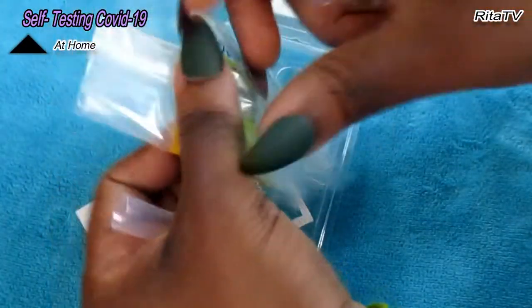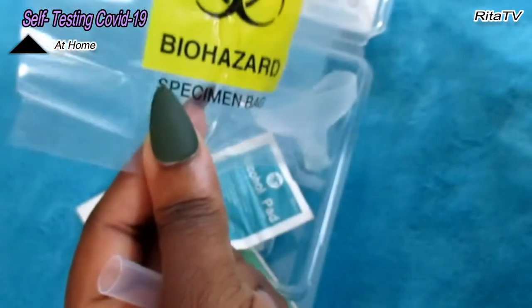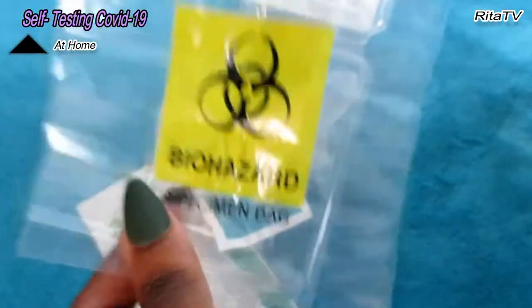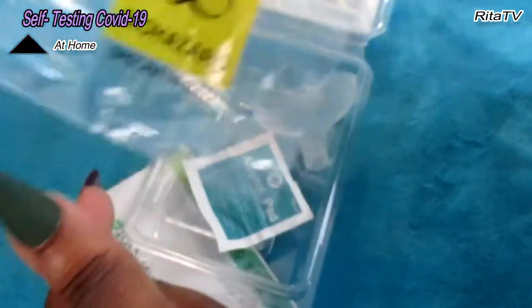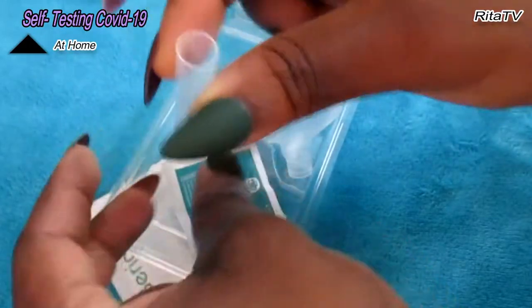Then we have the biosafety bag. This bag is where you put your test after you're done with everything. You put it inside. It has a seal. You seal it properly and trash it. So guys, now I'll be putting my saliva inside this thing.